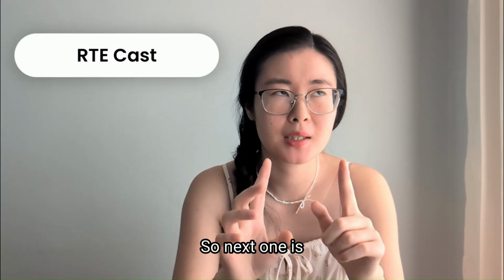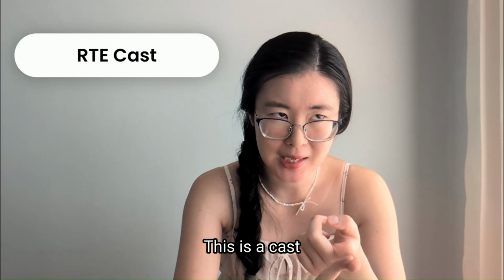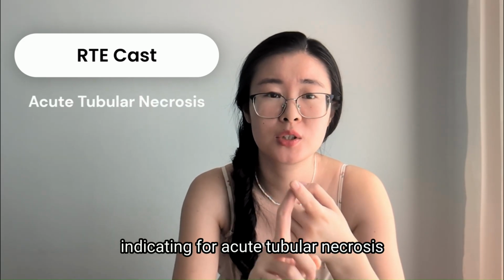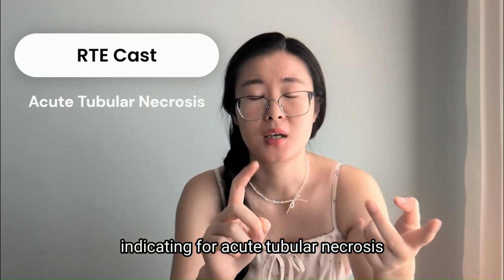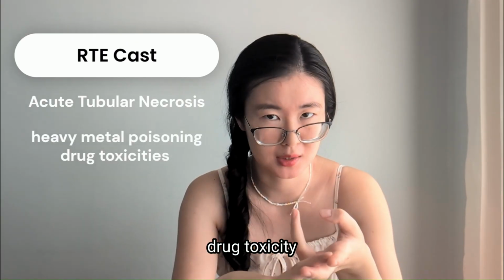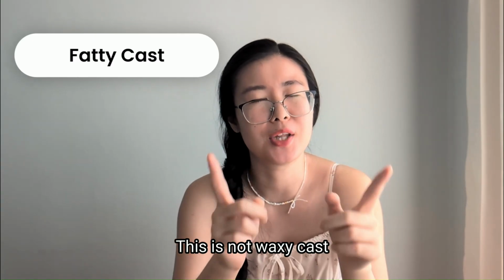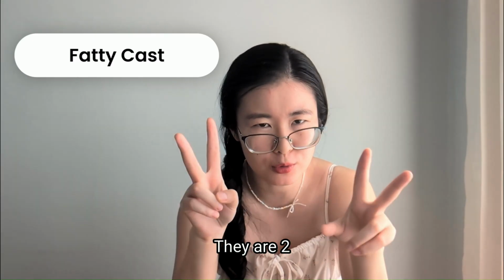So next one is the renal tubular epithelial cast. This is a cast indicating acute tubular necrosis. Common causes would be heavy metal poisoning and drug toxicity. Next one is the fatty cast. This is not waxy cast. They are two different things.